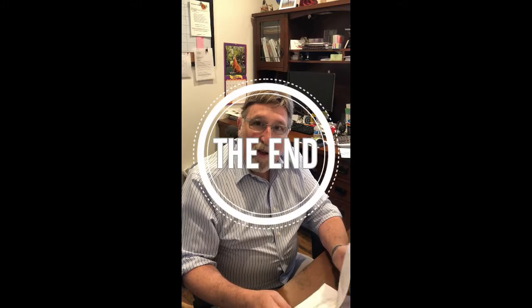My name is Stephen Chrome. I'm the veterinarian at Santa Rosa Veterinary Hospital, and I'm evaluating Abby Moreno for her radiology skills. Abby has been taking radiographs for me prior to our electronic system. We had a processor and she did excellent with that. Much better now that we have radiology as electronic systems. We do have dental x-ray capability too, and Abby Moreno has been excellent at doing x-rays for us, both thoracic, abdominal, limbs, and dental.